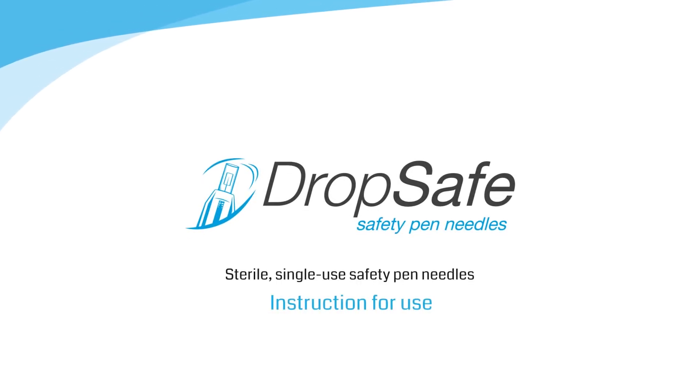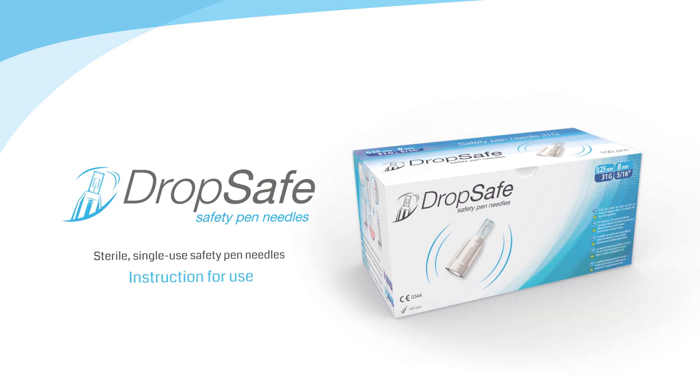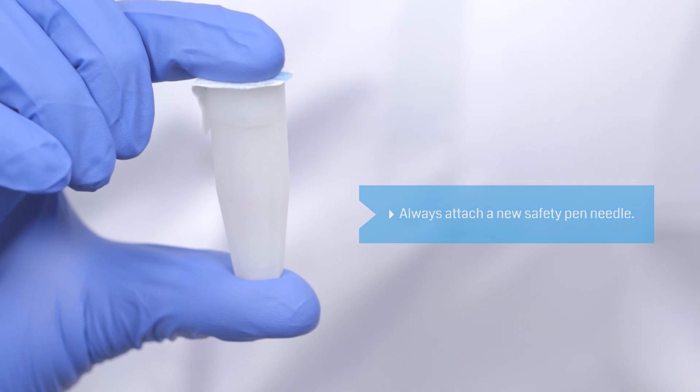DropSafe safety pen needles. Instructions for use. Before injection, always remember to attach a new safety pen needle.